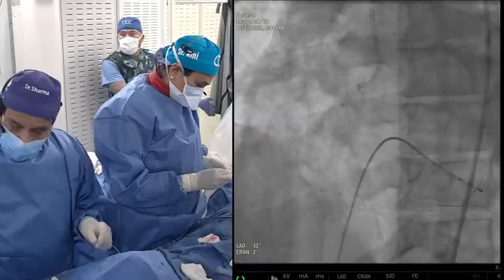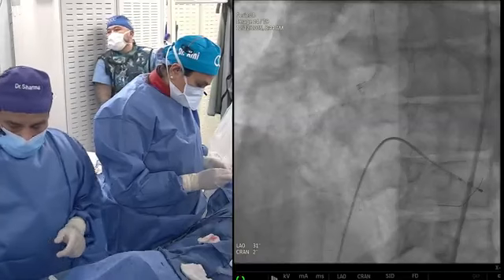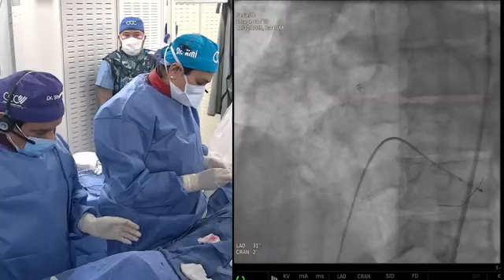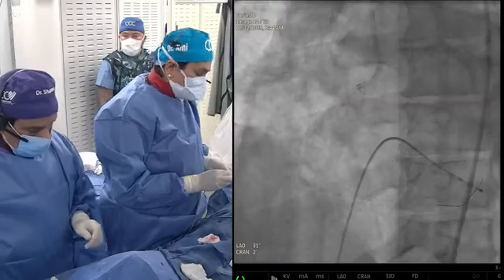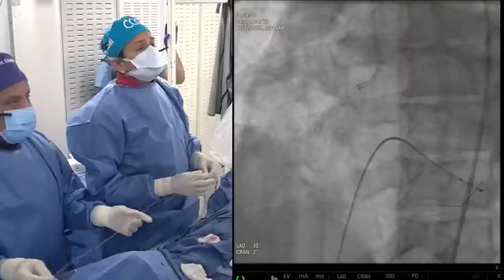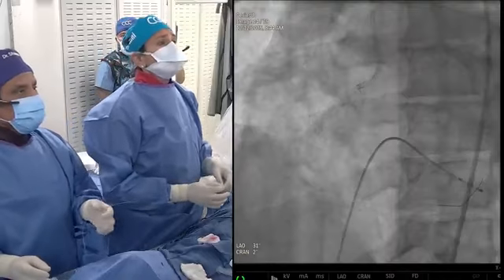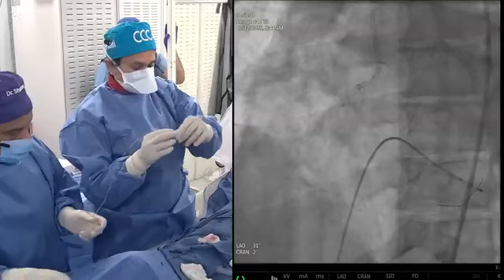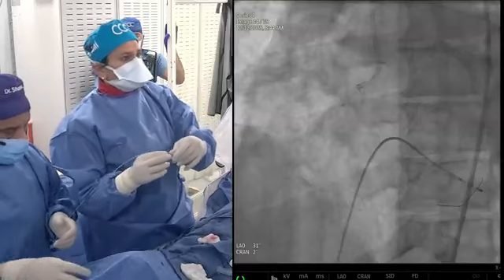That's a good one. So we decided 1.75. Distally, I don't think you need 20. So you put a 16 stent distally, and proximal you put a long stent. That's mid. Okay, 20 is good. No, you opened that already.